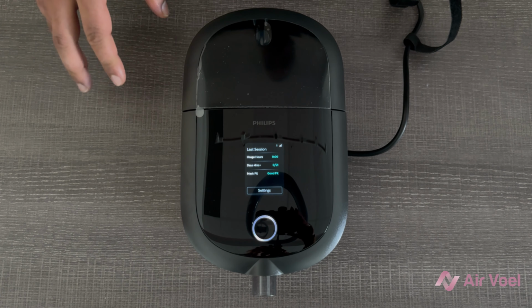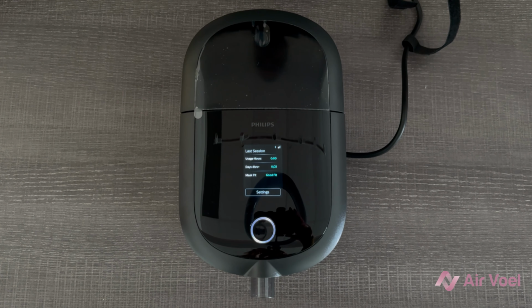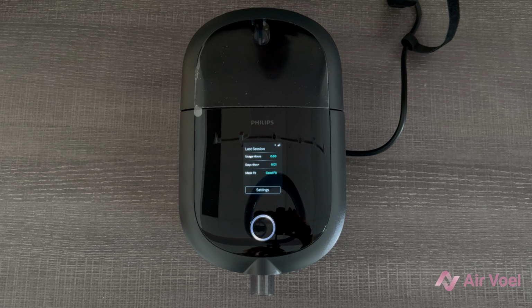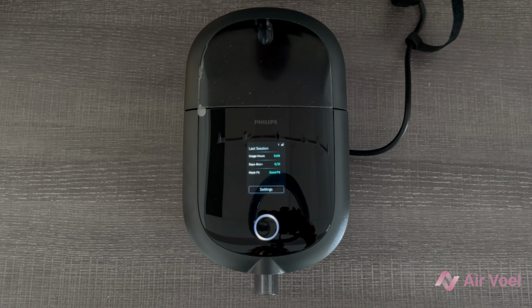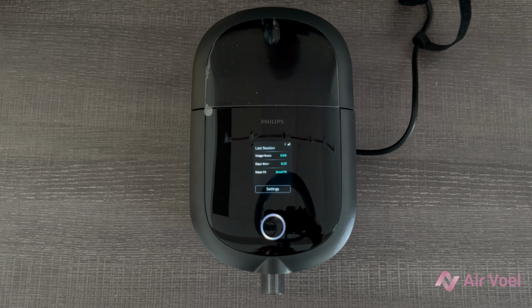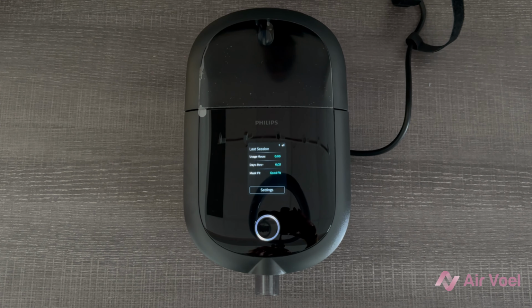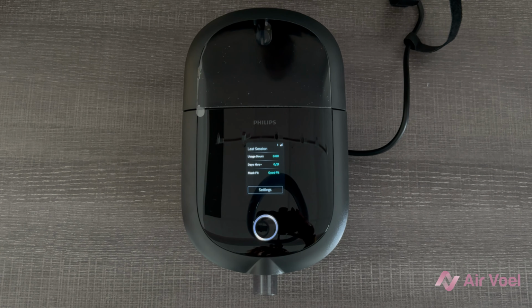Please note, settings like auto start, where you want the machine to turn on on its own when you put on the mask, is not available in the clinical menu of the DreamStation 2. Instead, if you want that setting activated, contact the provider that you purchased the machine from, and they will be able to activate that setting for you remotely using their vendor cloud profile.